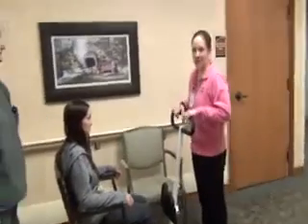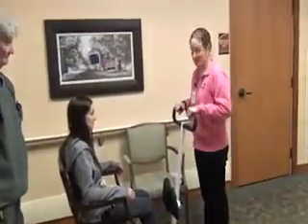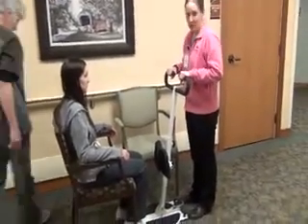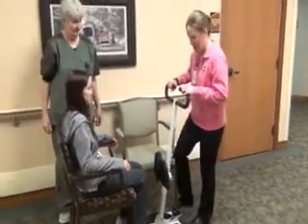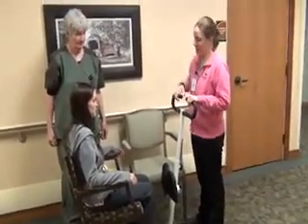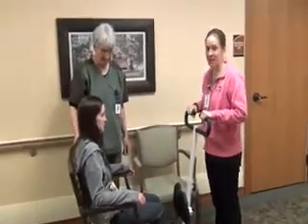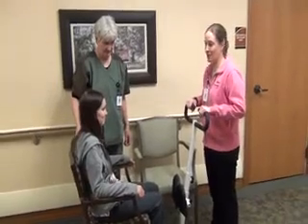The first person assisting, the one that is using the standing disc, needs to stay in front of the disc and they have to keep both hands at all times on the disc. The reason for this is once the patient is standing, they need to be managing the brake, the handles, and ensuring that this doesn't tip over. The second person is going to be standing next to or behind the patient, assisting them with standing up and making sure that they have their balance and are secure.